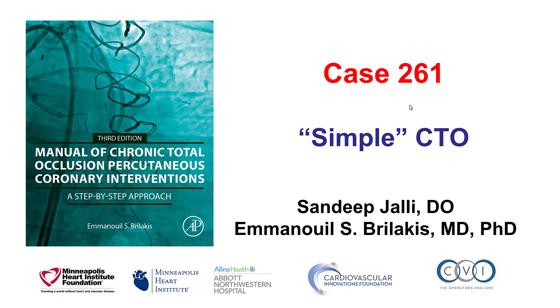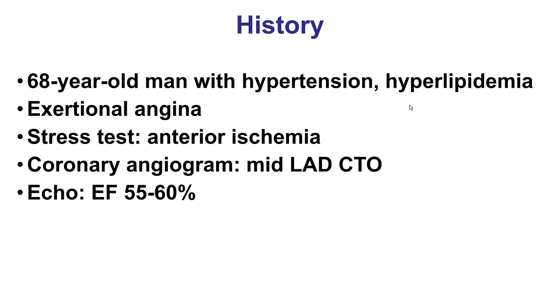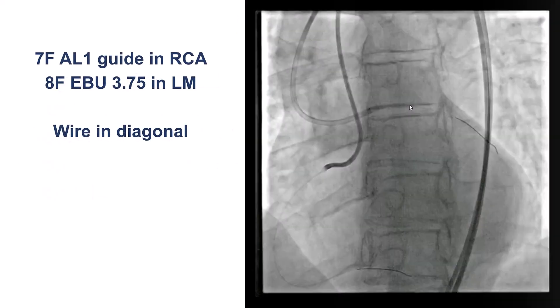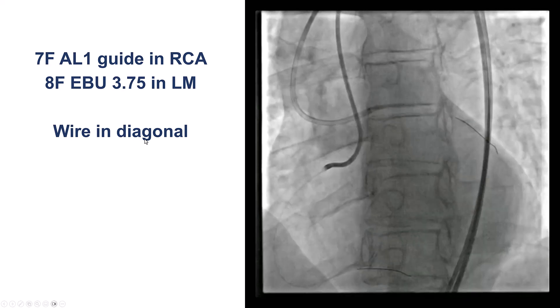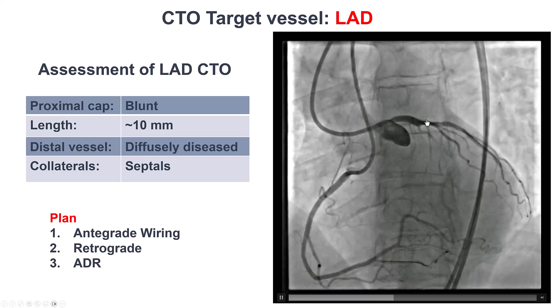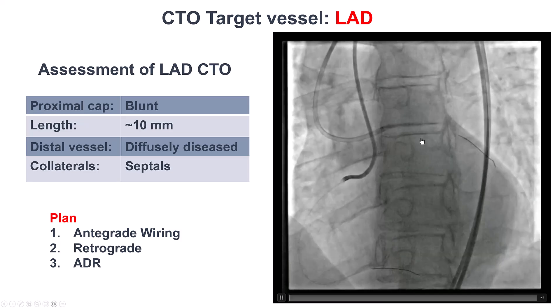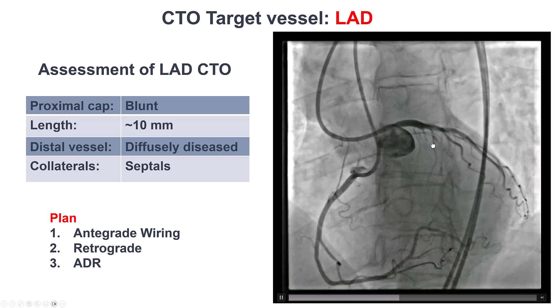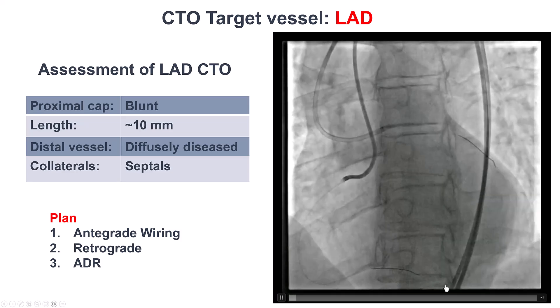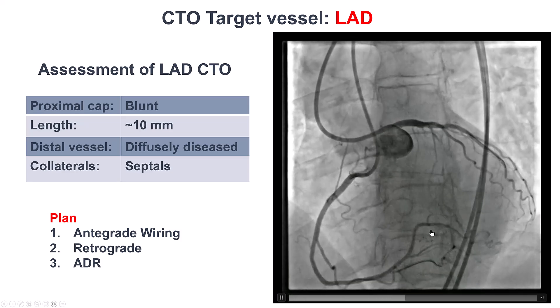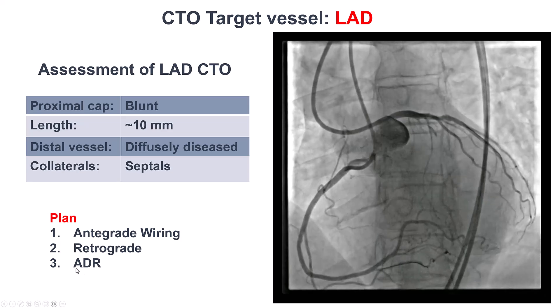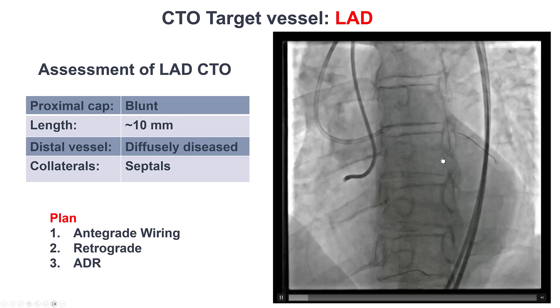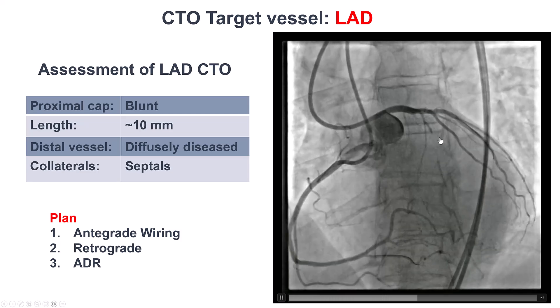This is a case of a so-called simple CTO. The patient presented with exertional angina, was found to have anterior ischemia with a mid-LAD CTO and a normal ejection fraction. The left was engaged with an EBU, the right with a 7 French AL1 guide. This is a dual injection demonstrating a CTO of the LAD with a relatively blunt proximal cap. Length is fairly short, about 10 mm. The distal vessel is diffusely diseased and filling through septal collaterals from the PDA. Our plan was to go with antegrade wiring. If that didn't work, retrograde through septals. If that didn't work, ADR — which is the least favorable approach for LAD CTOs because of the risk of losing diagonals and other important branches.